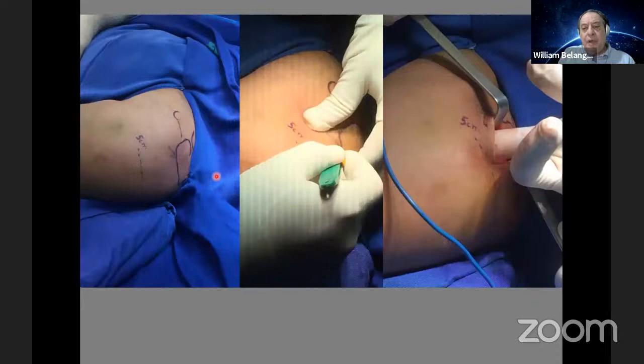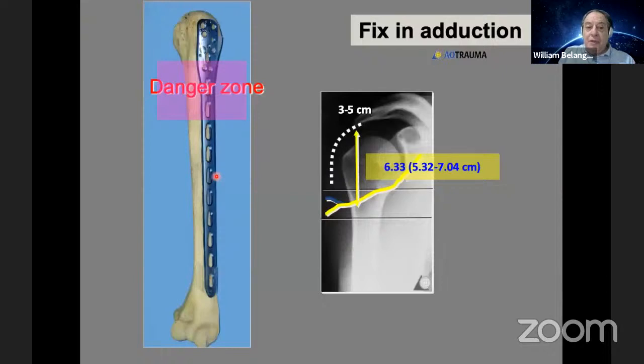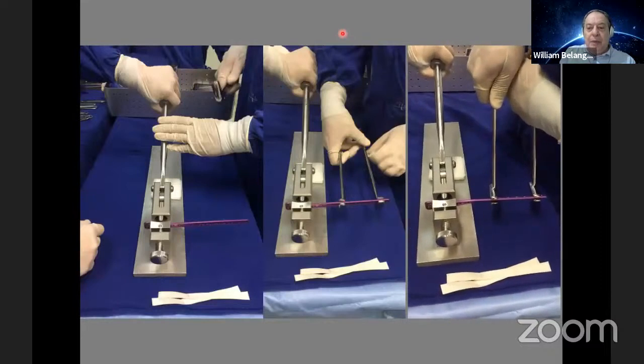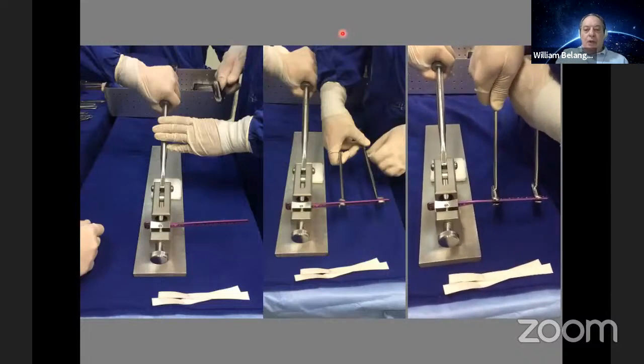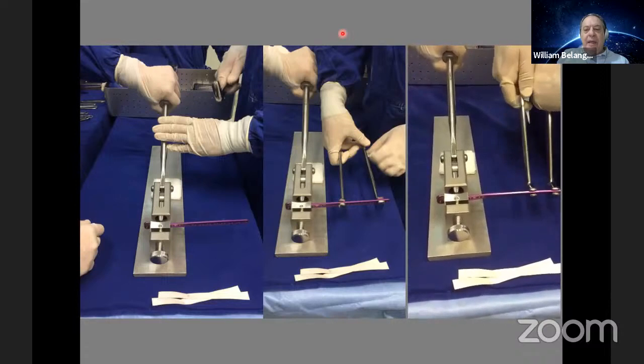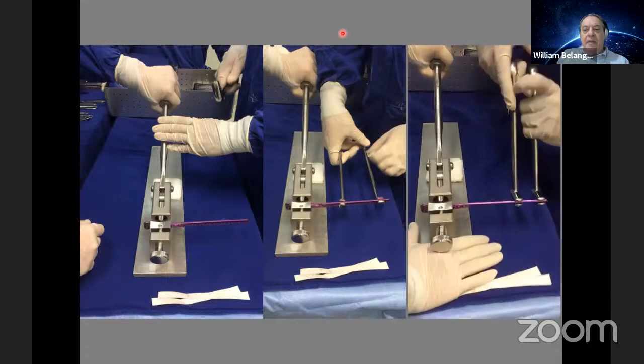Then we make the tunnel. This is the danger zone. We don't use screws in this part of the plate because you can damage the axillary nerve, and a very good recommendation is to fix it in adduction, okay? We need to bend the plate. We make this torsion of the plate. We need to twist the plate 80 degrees.